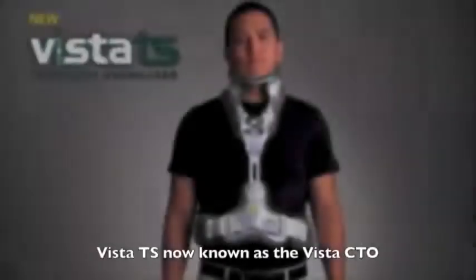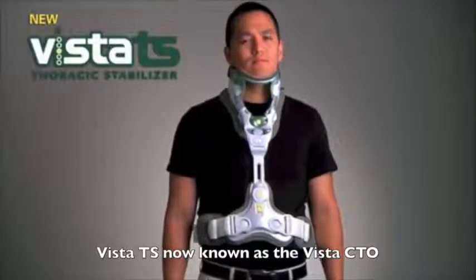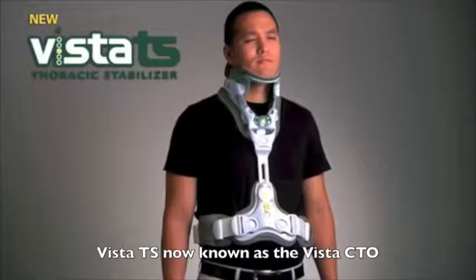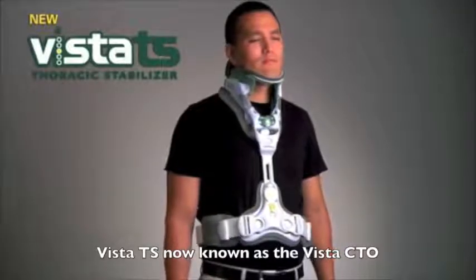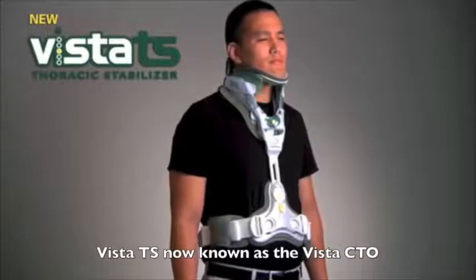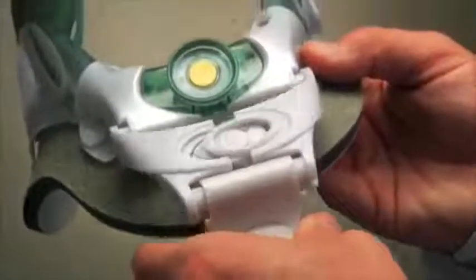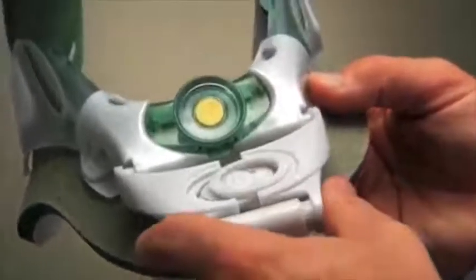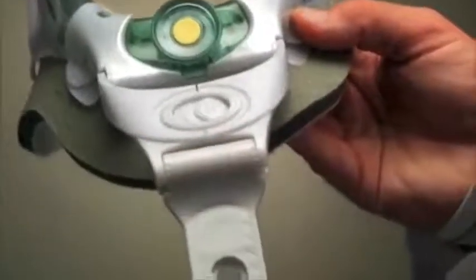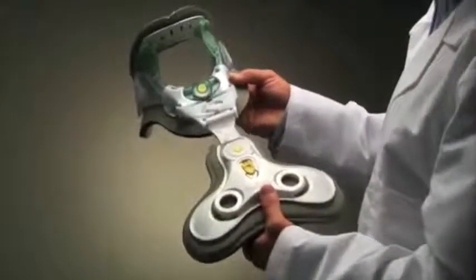The Vista TS has multiple adjustment points to ensure a comfortable, effective fit for the vast variety of patient anatomies. Like the Vista collar, the Vista TS is fully adjustable and only one size is required, reducing inventory costs and keeping patient care the main priority. The angle adjustment mechanism provides a customized angle for each patient's chest, while the height adjustment dial provides a custom length to each patient's torso.